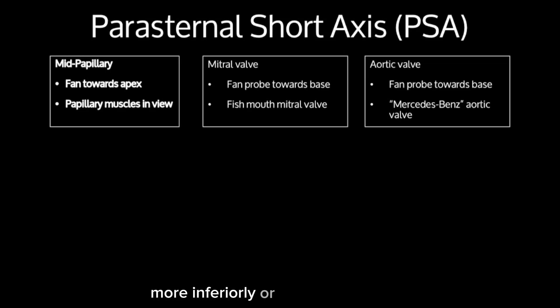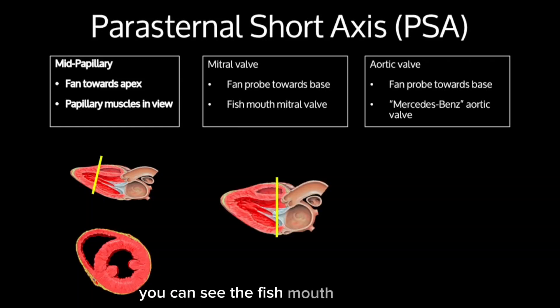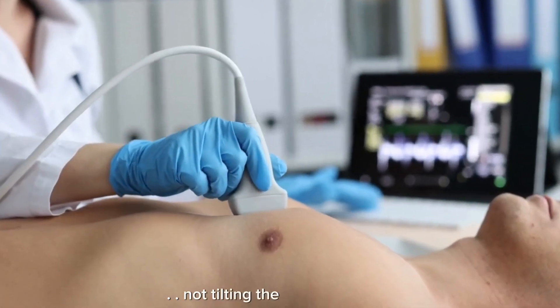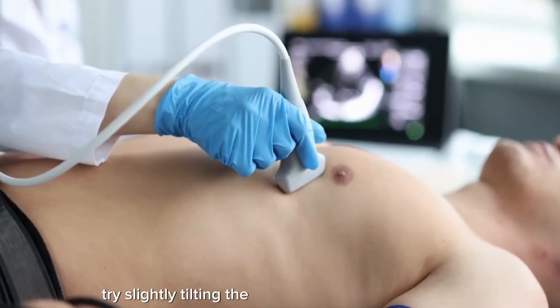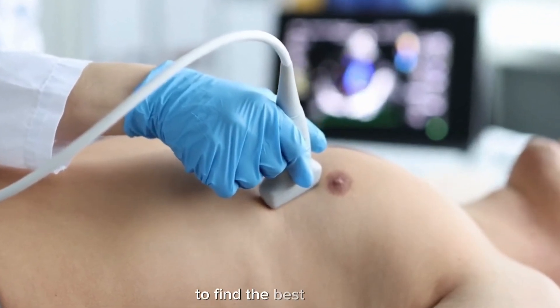More inferiorly, or towards the apex, is the mid-papillary view. Angling up towards the head, you can see the fish-mouth mitral valve. Most superiorly, you can begin to see the aortic valve. Common mistake: not tilting the probe correctly. If your aortic valve isn't clearly visible, try slightly tilting the probe superiorly or inferiorly to find the best window.